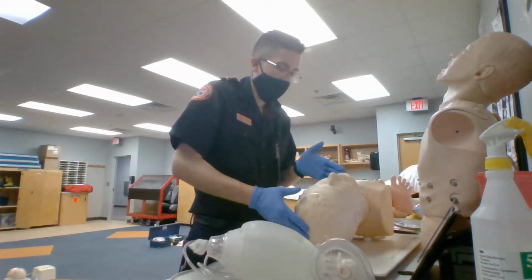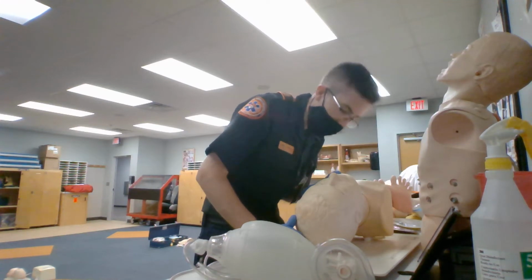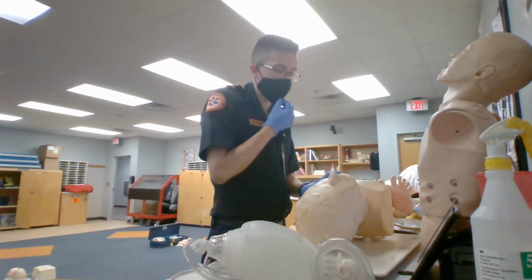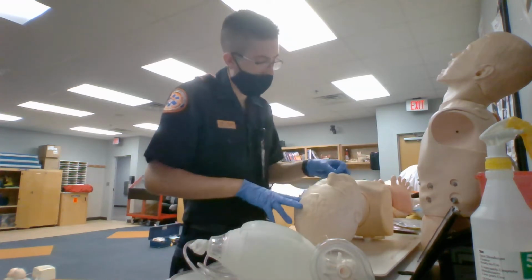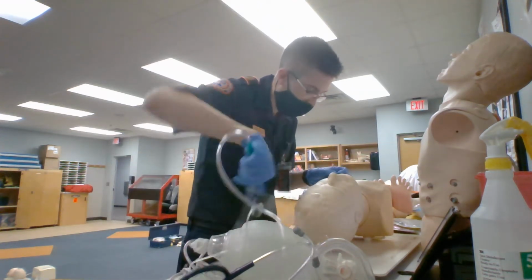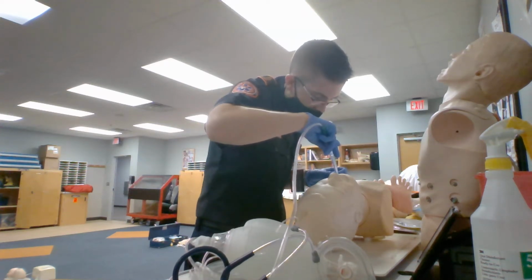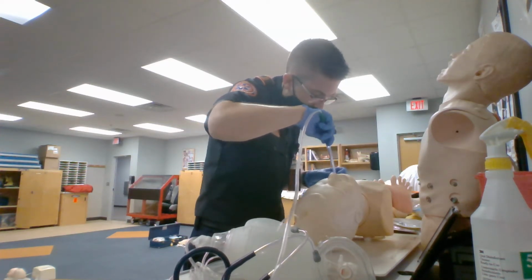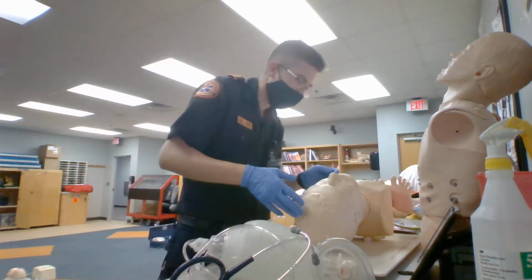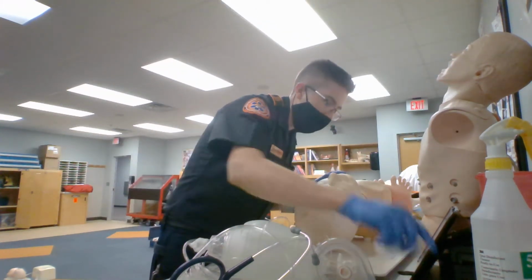First thing that I'm going to do, come over, open up my patient's airway, inspect the airway, inspect their nostrils, see which nostril is the least deviated as well as the biggest. And then I'm going to inspect their airway. If their airway has vomitous secretions or blood, I'm going to insert my suction device, suction for no longer than 10 seconds, only on my way out. Going to come over and make sure that my airway is clear.